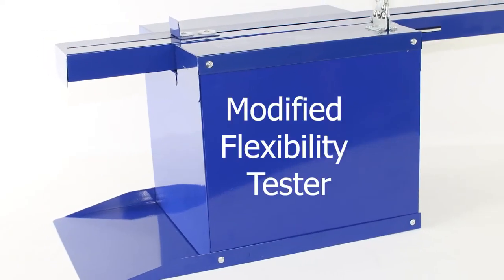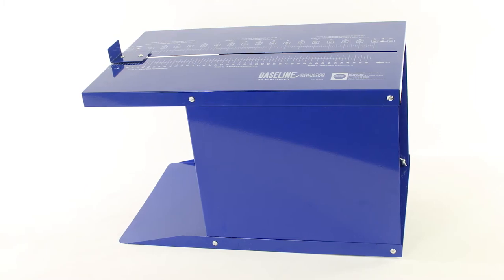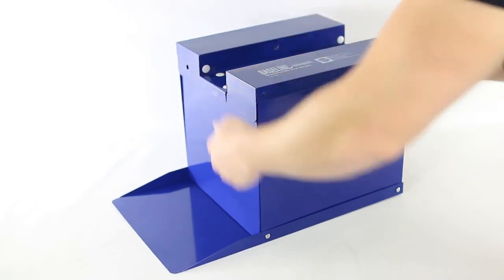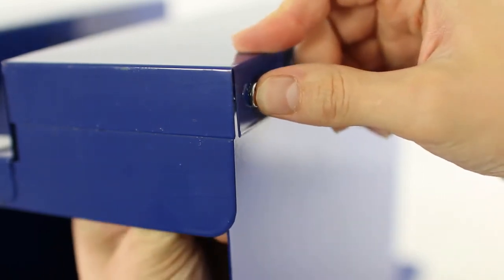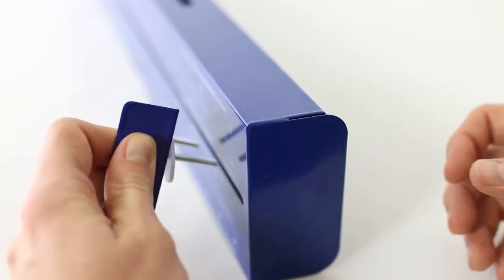To assemble the modified flexibility tester, follow step one from the standard flexibility test. Place the sliding channel on top with the baseline logo facing to the right. Insert the screws from the outside and tighten each of the wing nuts on the inside. Connect the slider to the sliding channel.